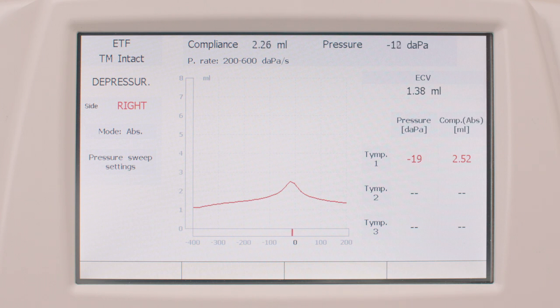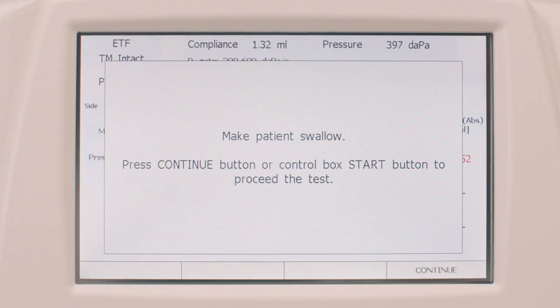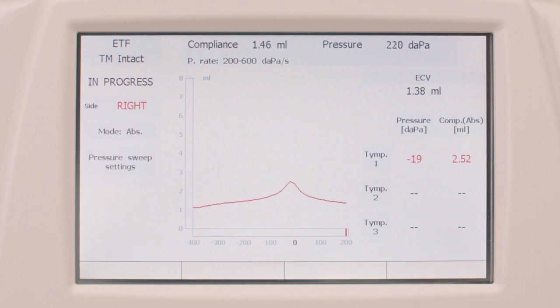This test protocol is based on the automatic acquisition of three tympanograms under different patient conditions, and since the interface is very similar to that of the tympanometry test described in the previous video, we will skip a detailed description. After the completion of the first tympanometry test, the patient is asked to swallow several times, therefore forcing the opening of the Eustachian tube. Once the patient has complied with the instructions, simply press the continuous function button to start recording the second tympanogram.